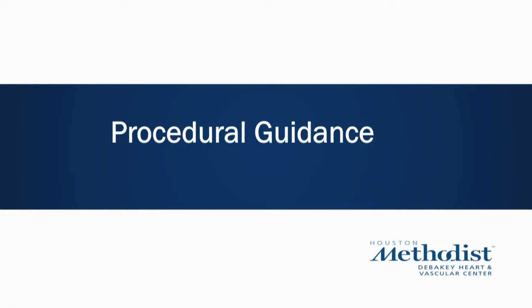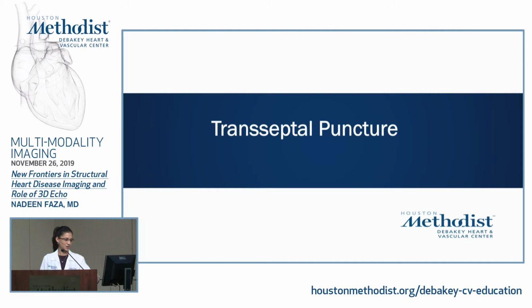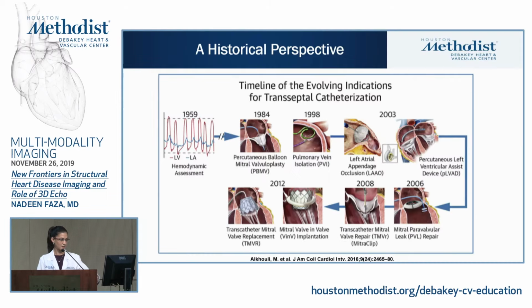All right, we talked about procedural planning. Let's talk about procedural guidance. And 3D echo is key in procedural guidance, especially for mitral interventions. Let's start with the transseptal puncture, which is not only used in mitral interventions, but also in EP procedures and left atrial appendage occlusion procedures.